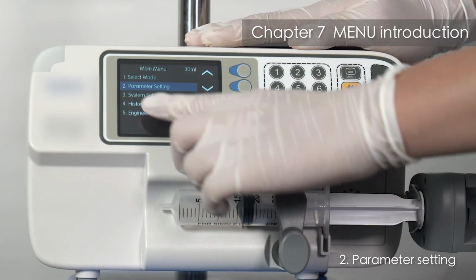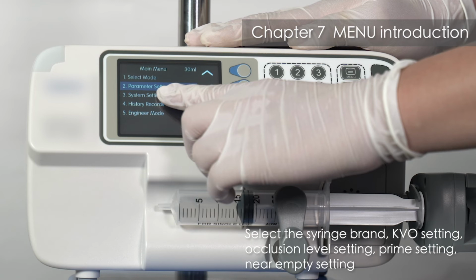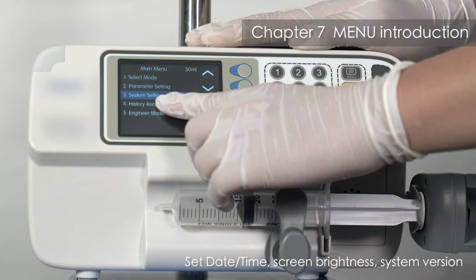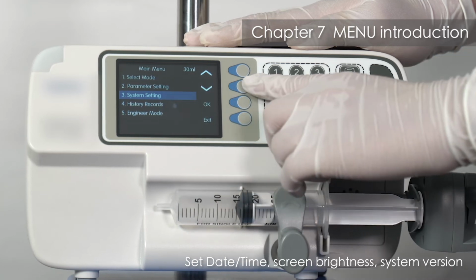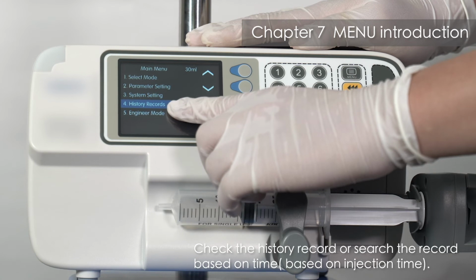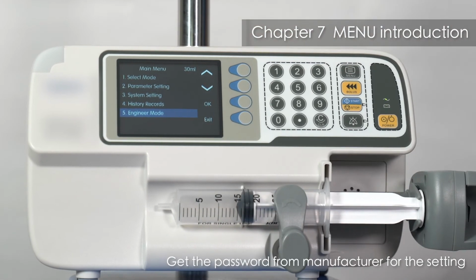2. Parameter setting. Select the syringe brand, KVO setting, occlusion level setting, prime setting, near empty setting. 3. System setting. Set date, time, screen brightness, system version. 4. Event log. Check the history record or search the record based on injection time. 5. Engineering mode. Get the password from manufacturer for the setting.